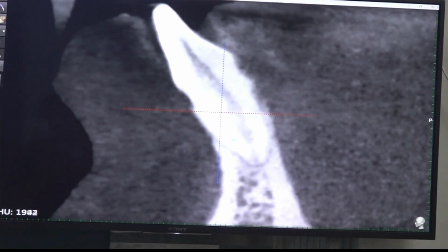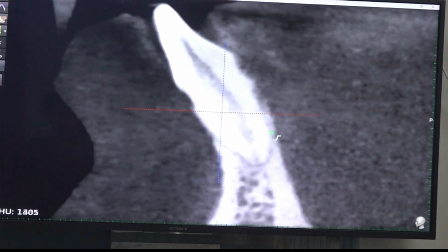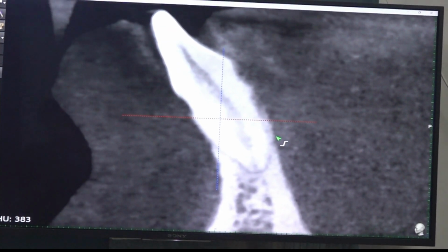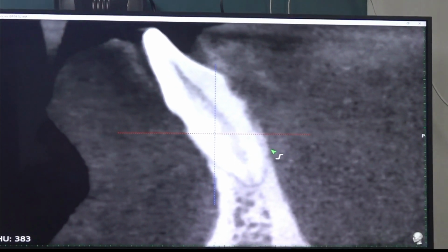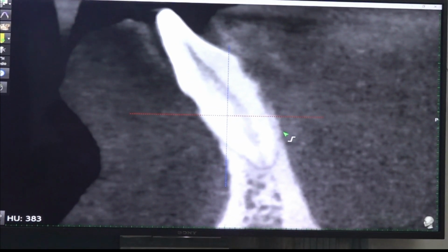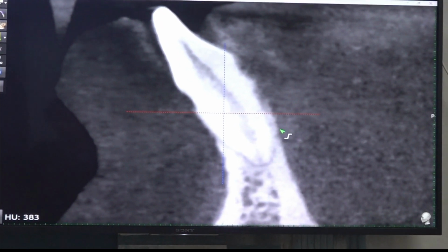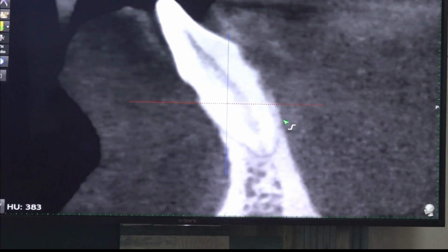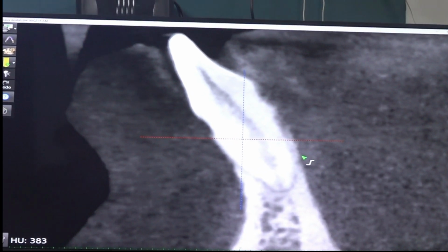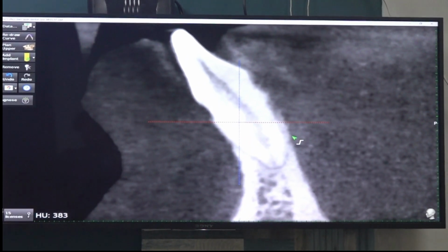See, in this situation, if you do alveoplasty till here, where I am showing the mark, then you can place compressive also. But can you do alveoplasty till that height? If you do, the adjacent canine bone will get compromised. So there is a limit to the alveoplasty we are doing. If you are doing full mouth, there is no limit.